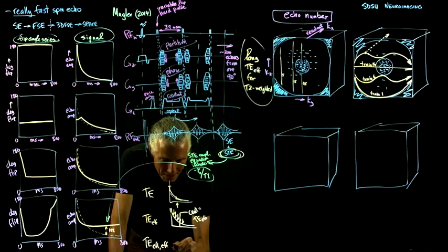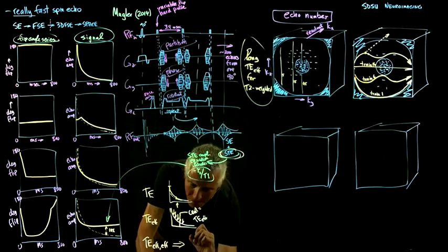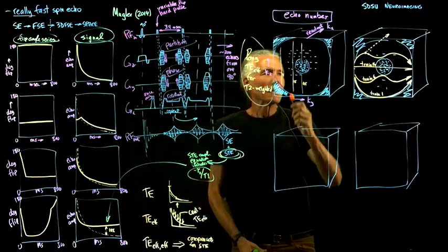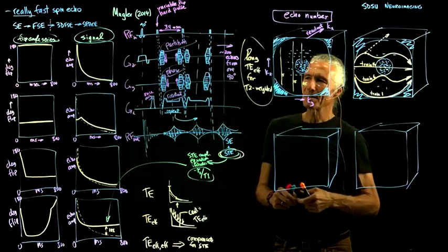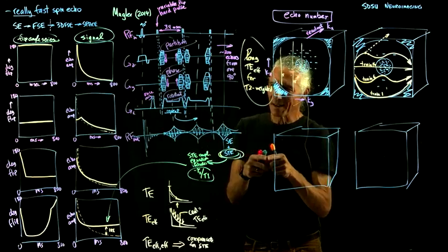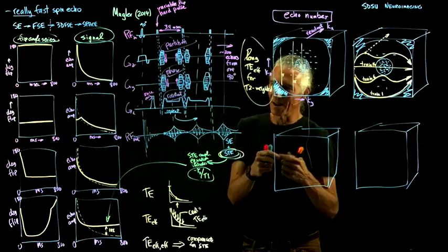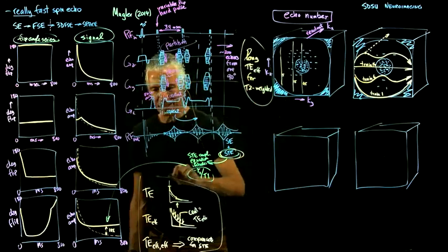And so what they do is they put a much smaller number, to essentially compensate for the stimulated echo, or STE. So not only is it the time of how long you took to go through the center of k-space, but that number is going to be like 300 milliseconds. That doesn't compute. It doesn't seem like any reasonable echo time. It's way too long. And so then they modify it again. So then you look on the interface to set a number that is similar to what you would do if you were doing a fast spin echo sequence, but in reality, it's 10 times as long. Yeah, so you can begin to see what the problem is after you really start optimizing these things.